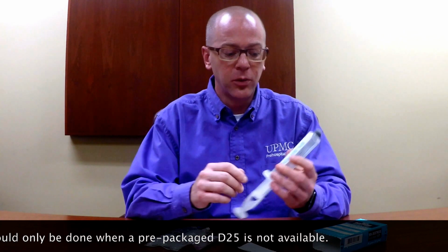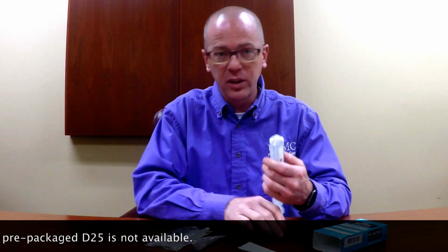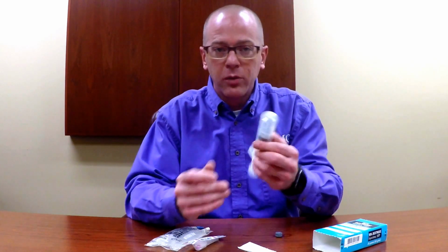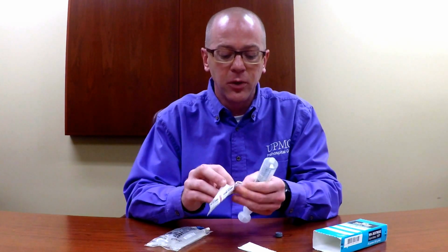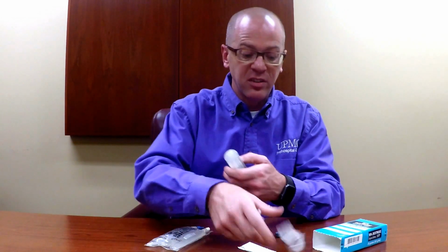As we connect the pre-filled, we would note that we have 50 cc's, and what I want to do initially is just waste half of this volume. So I'm going to use the trash can here beside me, and I'm going to push this down until I have 25 cc's remaining. So now we would approximate that I have 12.5 grams of the initial 25 of glucose left in the pre-filled, and what I need to do is return the volume to the initial 50 cc's.